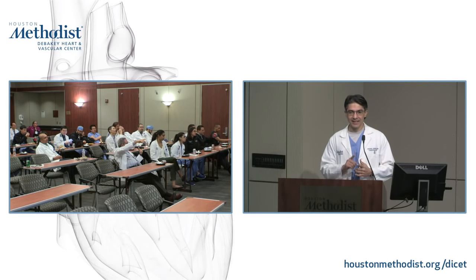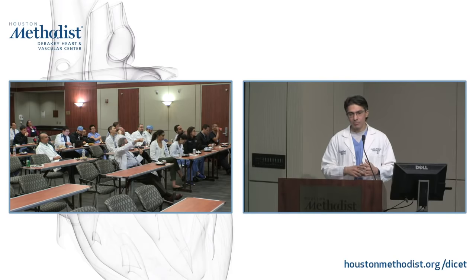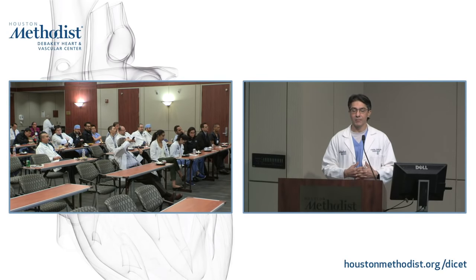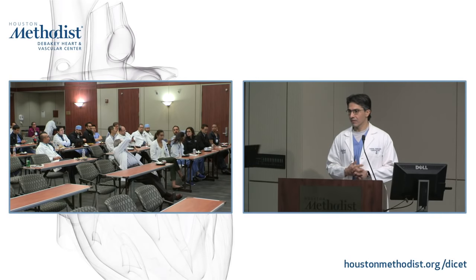I don't remember the exact case, but what I will say is you'll find where CMR will struggle when differentiating thrombus. If the mass is very, very small or very highly, rapidly mobile, we're going to have a hard time. Our images are made over several cardiac cycles, so we're going to have a little bit of difficulty. Because I think with the CT, it was... You remember the case more, Carlos?